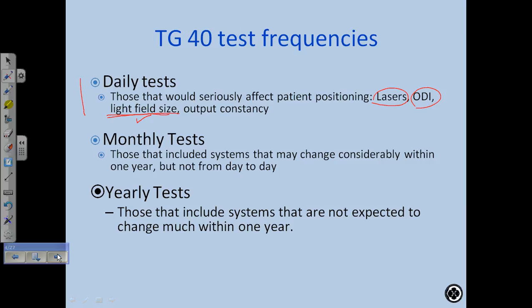So this caused a big uproar in the medical physics listservs about how it's unreasonable to expect us to do that. We check the light field size every morning. I think that's good enough.